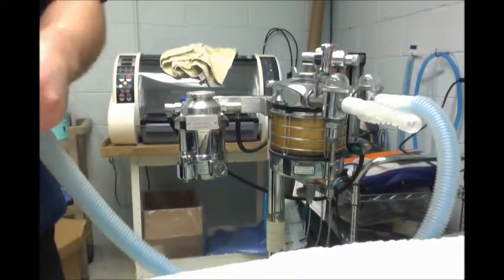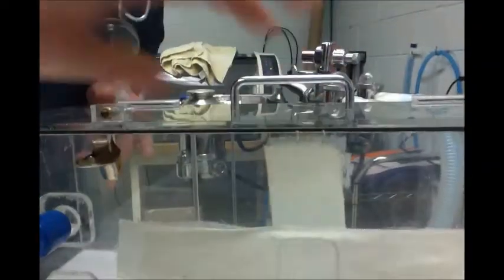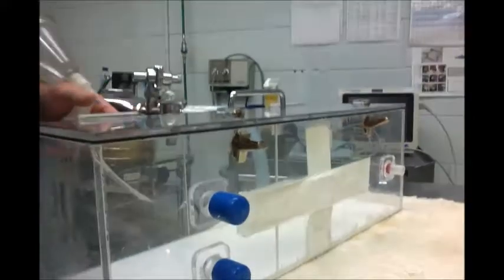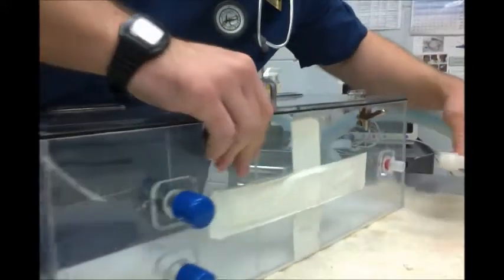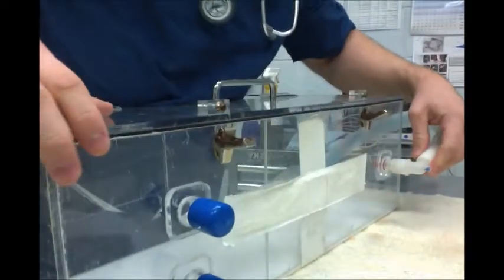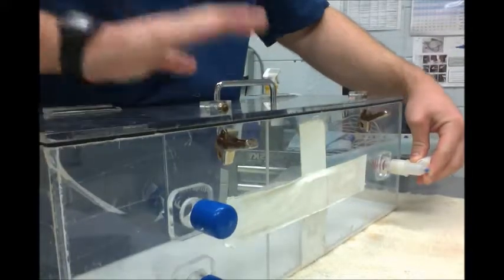This is an induction chamber, which we use on cats a lot. So what we can do is hook this straight up to there, and we can get an induction that way with a cat directly in there.